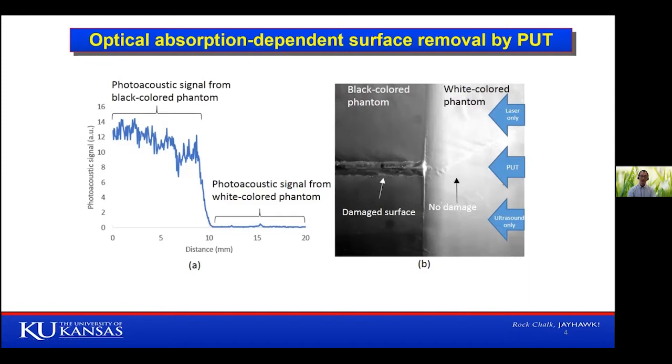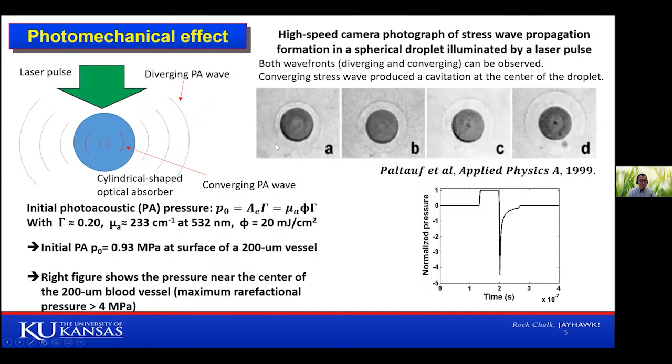So what this gives us is, again, still an ultrasound technology, but this ultrasound therapy is based on optical contrast. It's kind of like we added selectivity to traditional ultrasound therapy, because traditional ultrasound therapy, no matter thermal therapy or cavitation therapy, has not much selectivity. But now, with the concurrent use of laser, we are able to remove just the tissue which is highly optically absorptive.